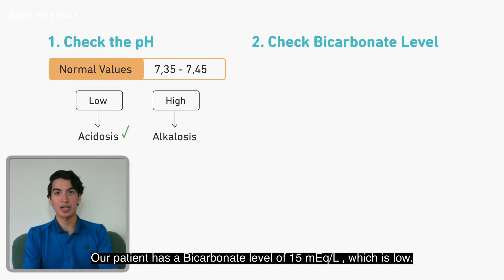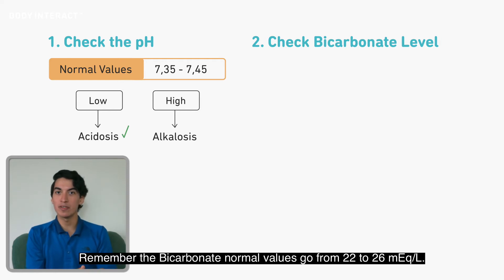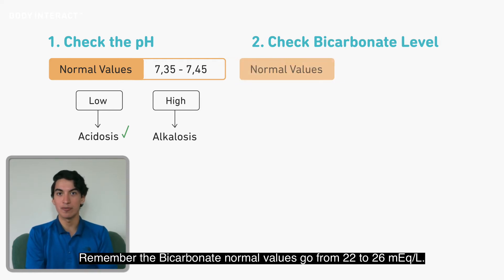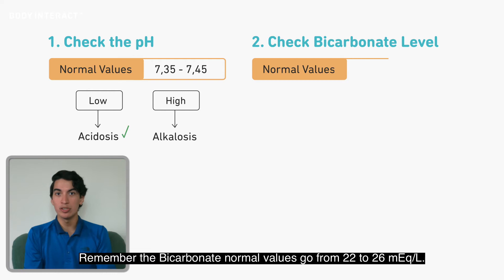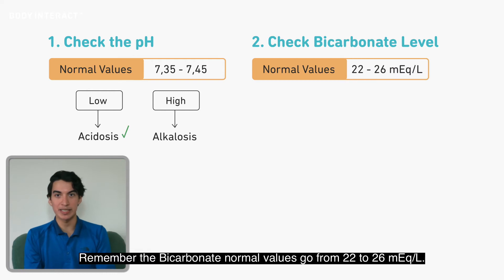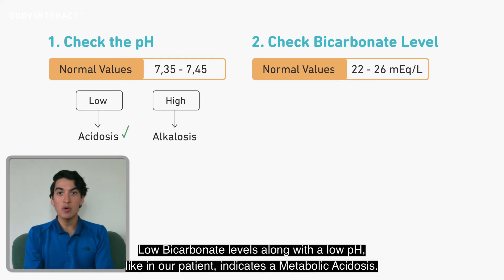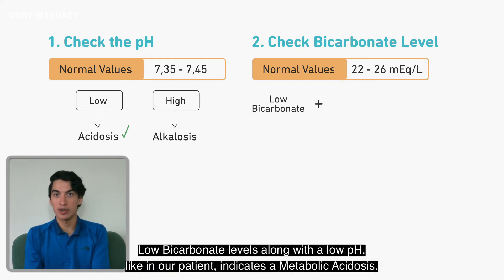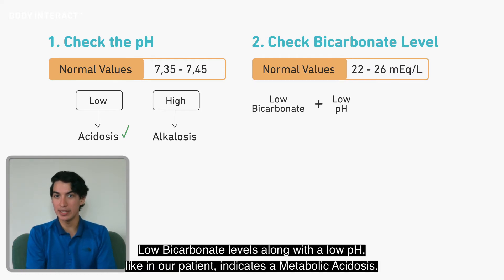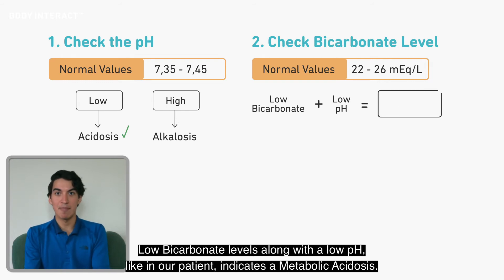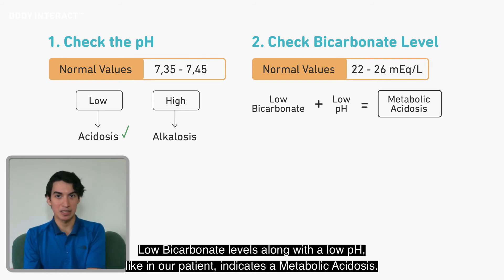Our patient has a bicarbonate level of 15, which is low. Remember, the bicarbonate normal values go from 22 to 26. A low bicarbonate level along with a low pH, like in our patient, indicates a metabolic acidosis.